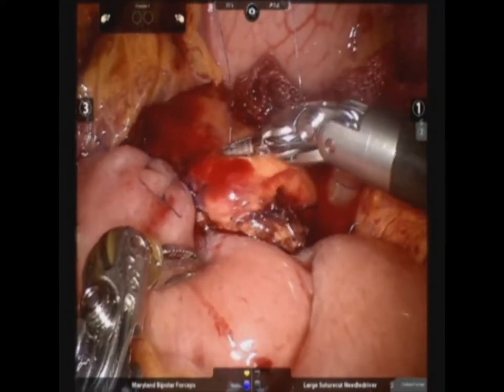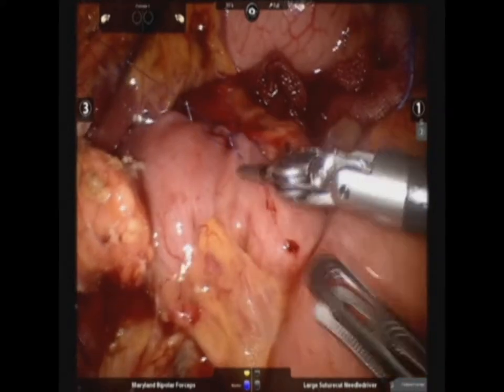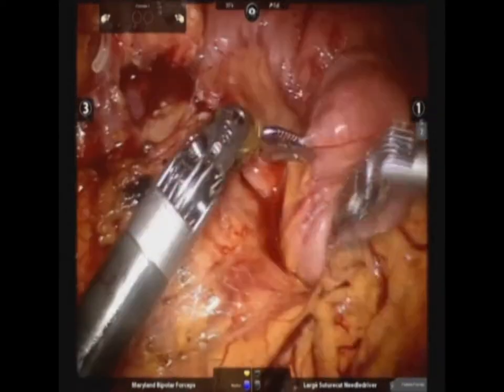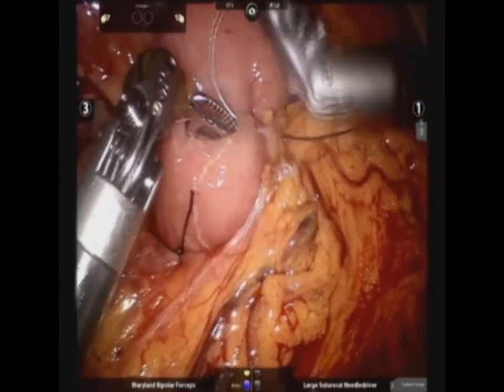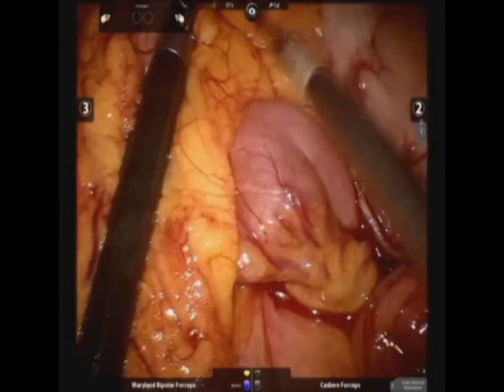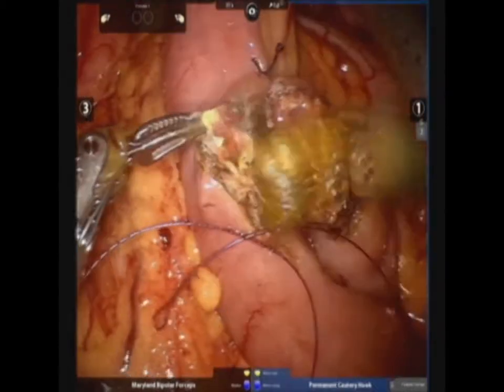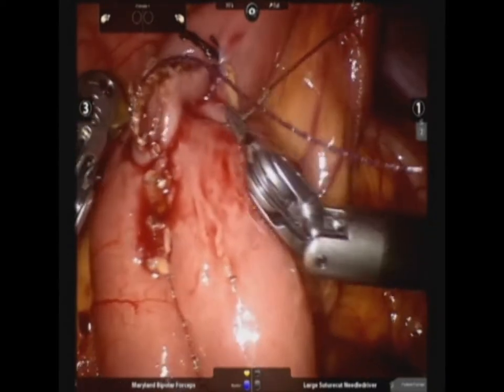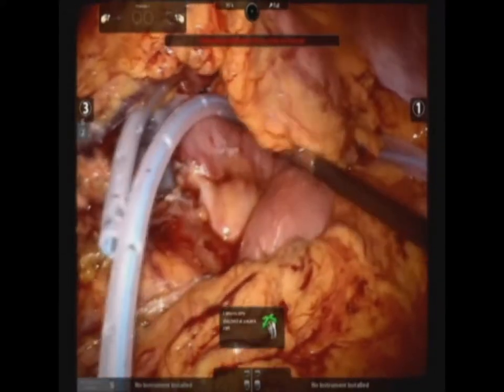Pancreaticojejunostomy was completed by anterior outer sutures. The defect of the mesocolon was fixed with the jejunal limb to prevent internal hernia. Finally, the jejunojejunostomy was made by intracorporeal anastomosis using the V-Lock 3-0 suture. The procedure was completed by indwelling a two-armed drain tube around the pancreaticojejunostomy site.